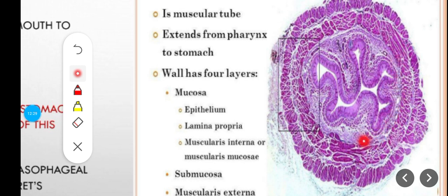Now, in some areas of the esophagus and generally the gastrointestinal tract, you might find some aggregates of lymphoid tissues, though they are solitary and isolated in most parts of the gastrointestinal system, except in a specific part of the small intestine and also a specific part of the large intestine that we'll review later.